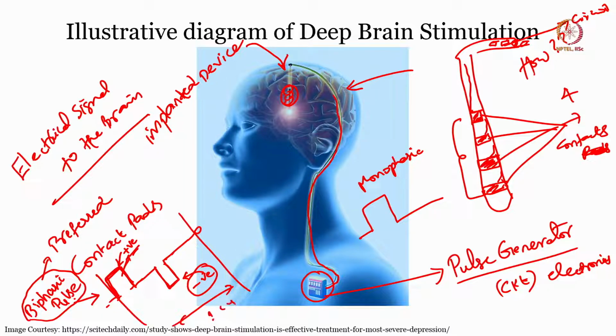let us say I call it one cycle. During that cycle, you send the positive charge and you retrieve the same positive charge, that means in terms of this negative, correct. So, you are having something called charge balance. The basic idea is you are not sending extra charges to the brain electrolyte.